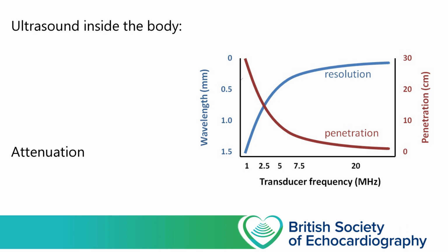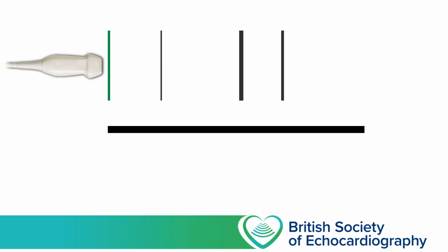2D images are typically generated using frequencies in a range of 4 to 7 million Hz, as we try to seek an optimal trade-off between resolution and penetration. So we've said that it's the returning wave that allows us to generate an ultrasound image. This is because the piezoelectric effect can work in reverse. Applying kinetic energy to the array of crystals generates a charge that travels back into the ultrasound machine and can be interpreted by the ultrasound software.